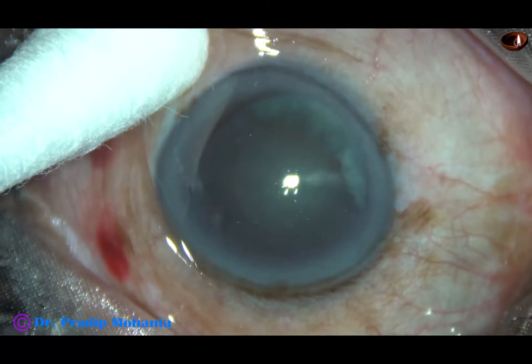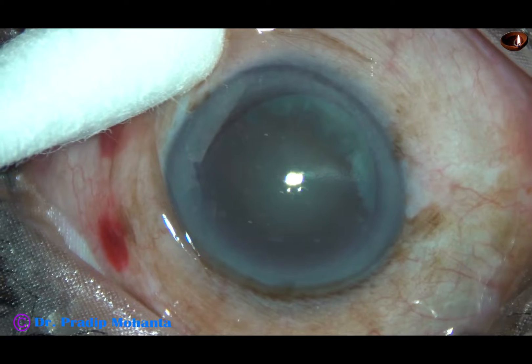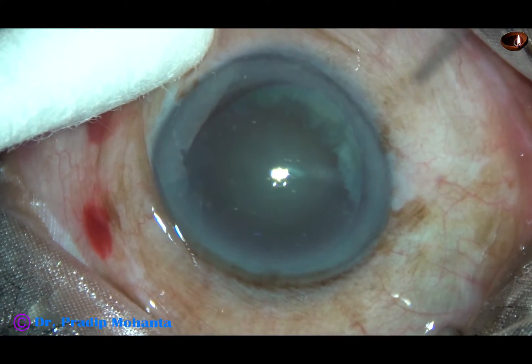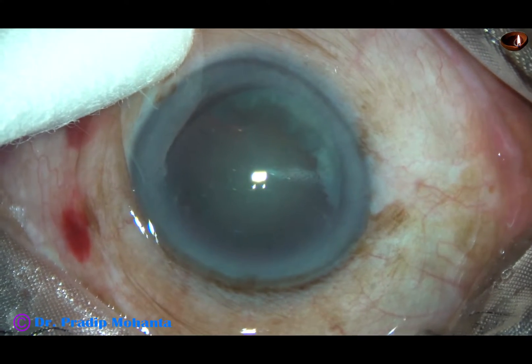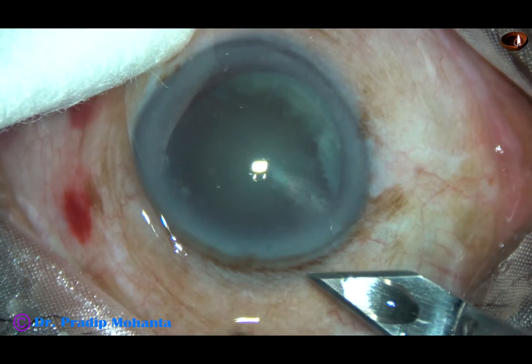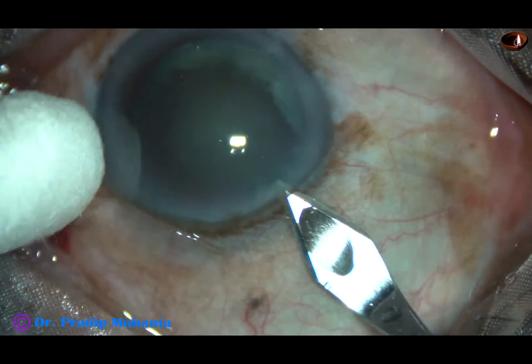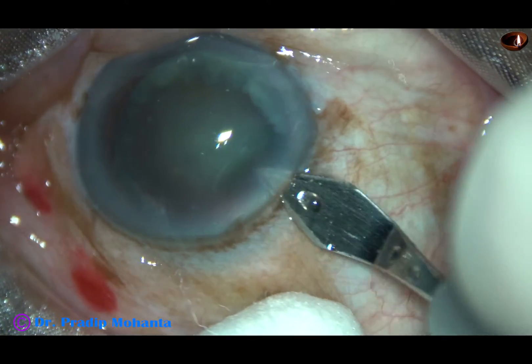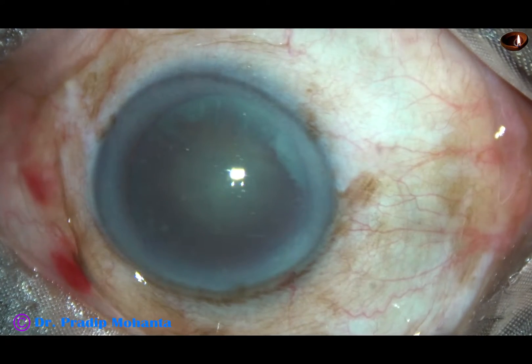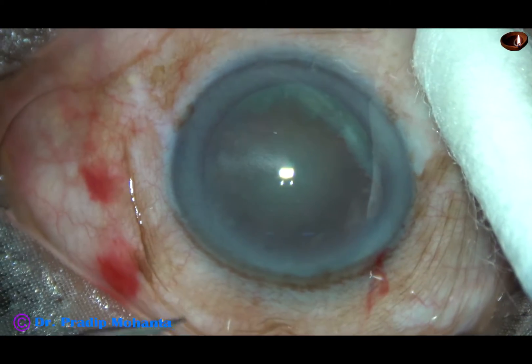This is a cataract with grade 3 nuclear sclerosis. In this case, I am going to demonstrate the stop and chop technique of phacoemulsification. Stop and chop technique is a beautiful technique. This is midway between divide and conquer and direct chop. So after doing direct chop for a few months, one can try this technique.